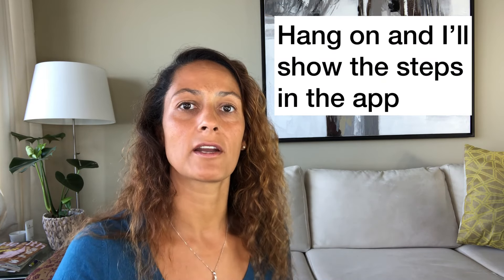Once you've put in your credentials and everything, you should be able to see your readings on your watch. Let me show you how to do that — I'm going to do a shared screen and show you on my phone.